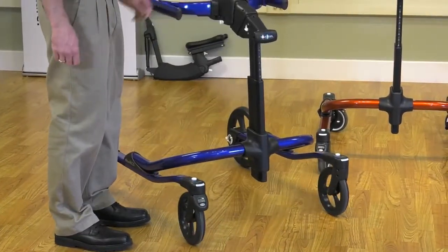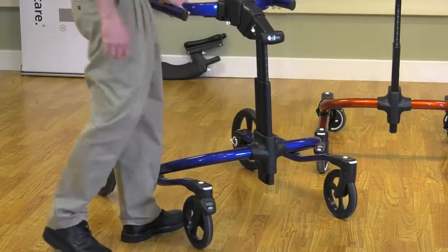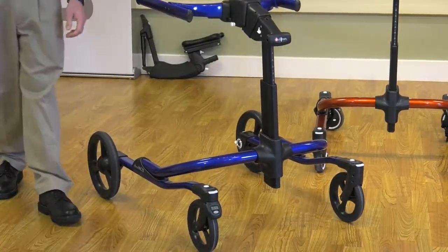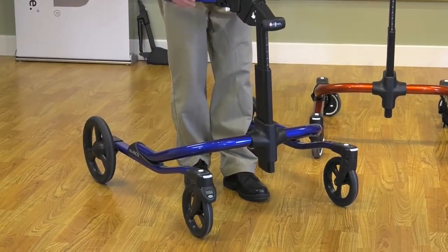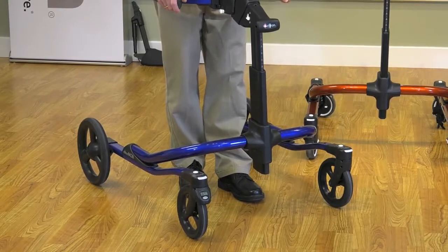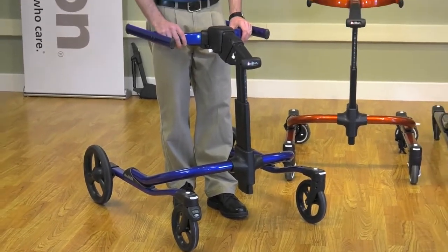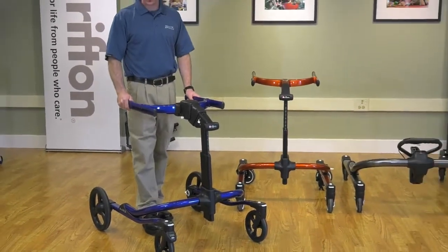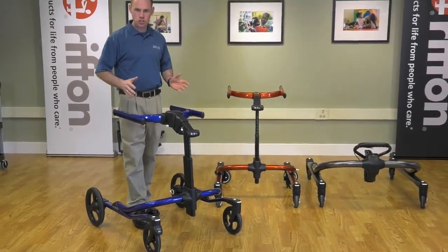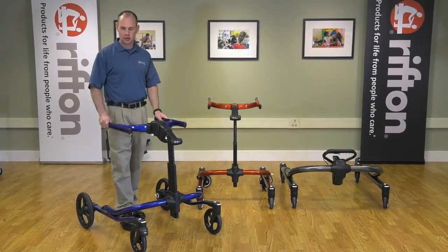And you've got your swivel. To lock it, just hit that button on top. And you've got the swivel locked out. And we do recommend using the swivel lock for dynamic, when you want to use the dynamic feature, because that keeps the Pacer in a straight course while the client is using the dynamic body support and shifting back and forth and up and down.